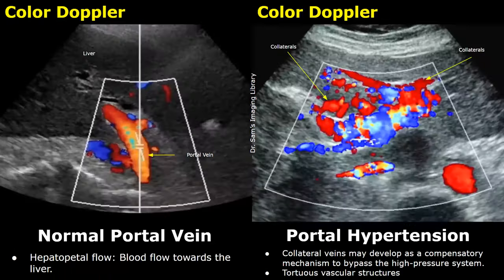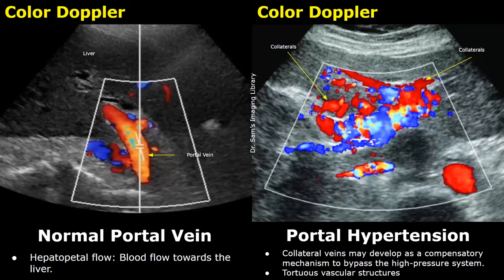In chronic cases of portal hypertension, collateral vessels may form around the main portal vein, and these collaterals can be seen with color Doppler. They will appear as tortuous vascular structures around the portal vein. The collateral veins may develop as a compensatory mechanism to bypass the high pressure system.